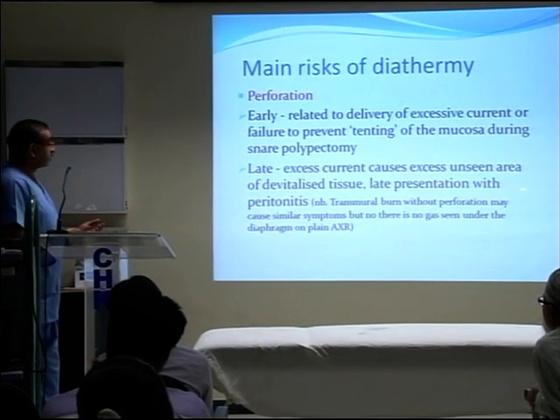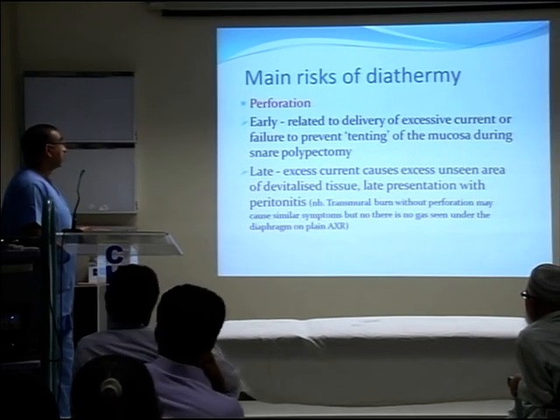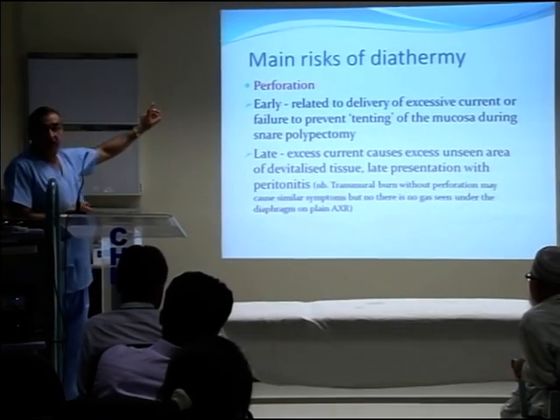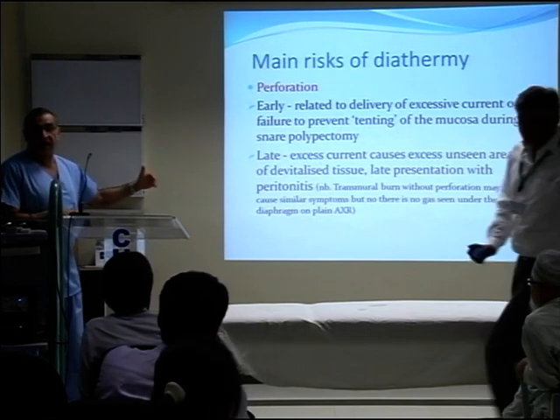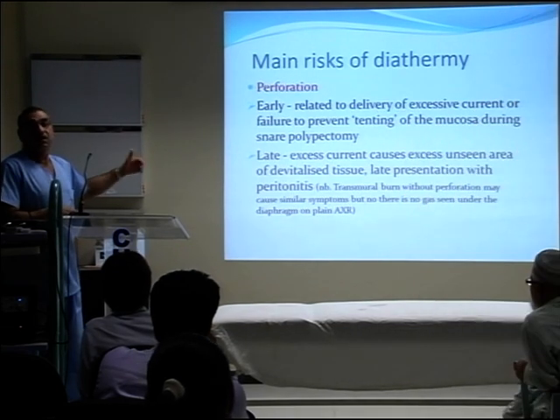Sometimes, which can easily happen, is that there's a late perforation, and that can occur due to excess current. As I mentioned to you, the diagram of devitalized tissue, you may get full thickness burns without you realizing, and after a day or 2 or even a week, that gives way.